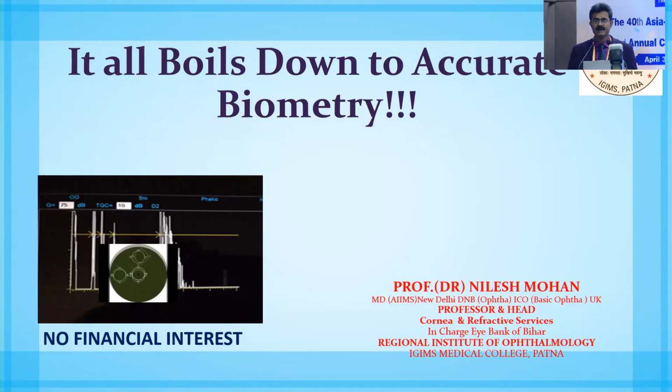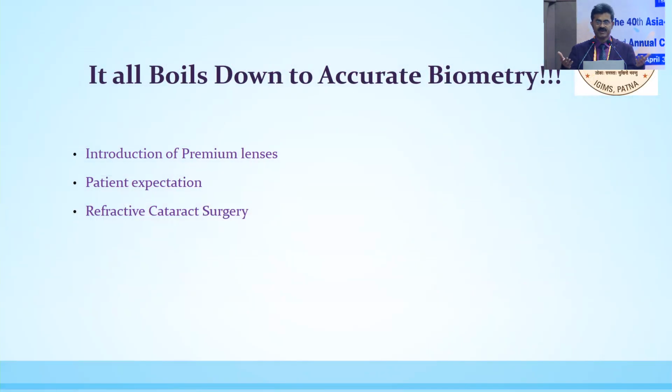So basically, this topic has been given because it really boils down to accurate biometry, because you are counseling the patient for premium lenses, and if you have drastic results or surprises, that's a concern. So why is it important? Because we are using premium lenses and the patient's expectations have gone high, and nowadays cataract surgery is being done as a refractive cataract surgery.